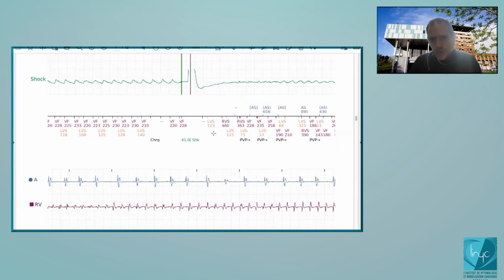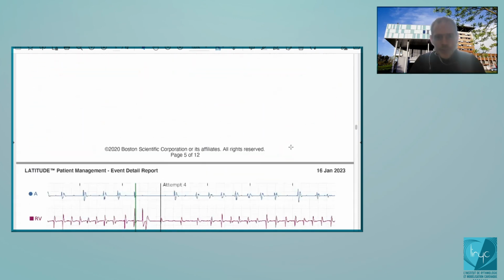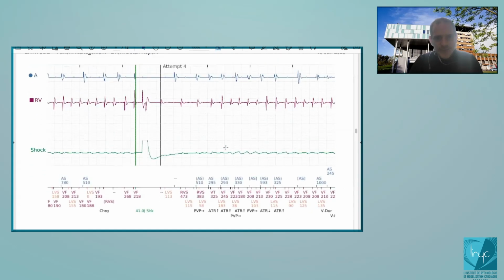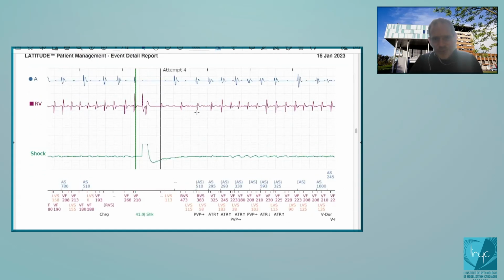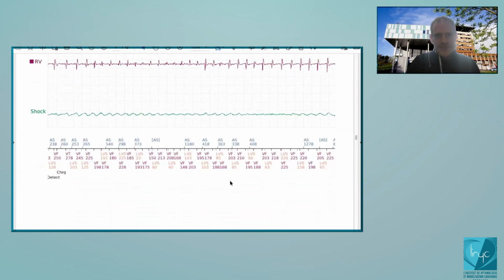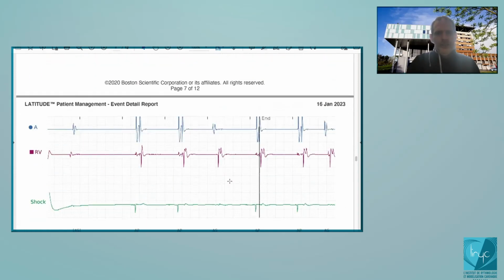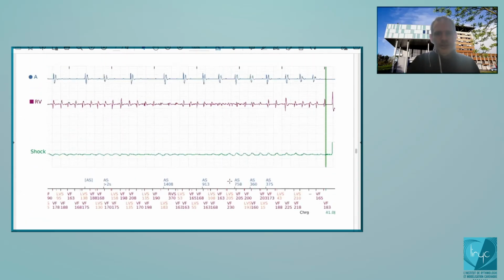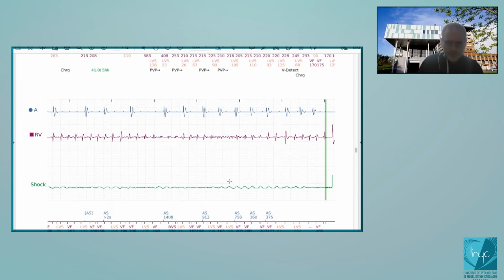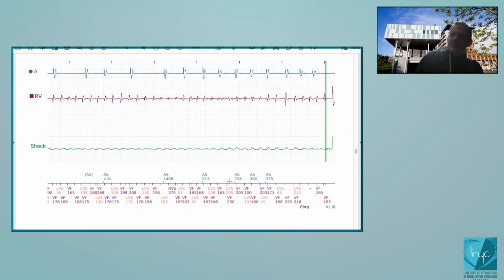And then once more, the same 1, 2, 3, 4, 5. So you will repeat all the time. The question of the efficacy of the shock is difficult. I don't think it is efficient, at least. And then there is recurrent arrhythmia. And then, okay. How many shocks can be delivered in Boston for the same episode? 8 shocks? Yes, 8 shocks. And a maximum of 8 shocks.